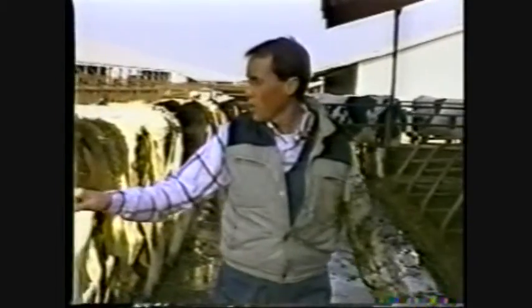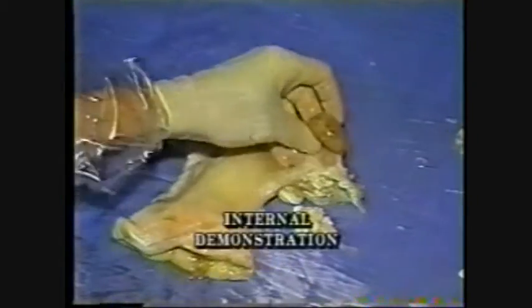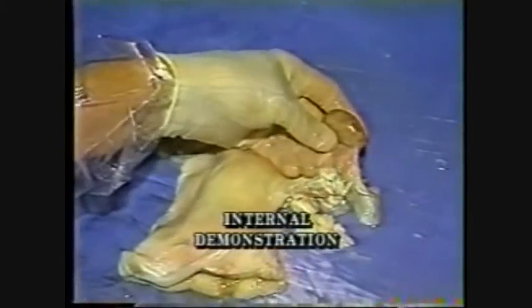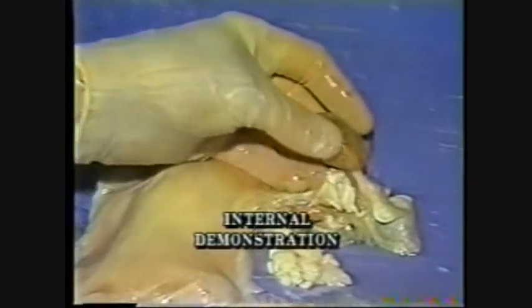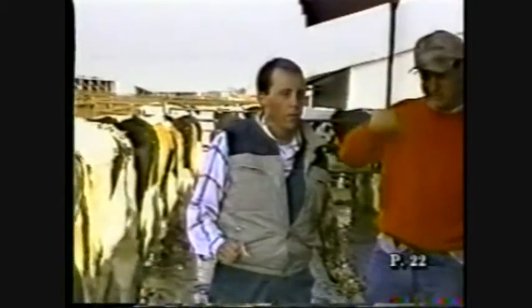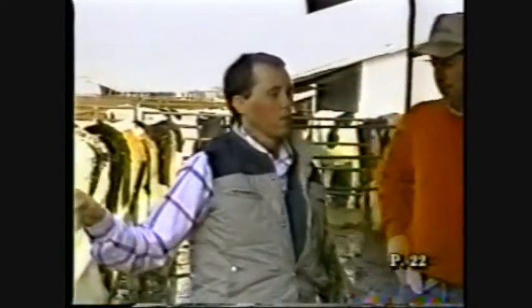Who's this next group? Guernsey no name. What did we find on her? CLR. She's all right, too. I wasn't really sure. I put R right over it with an F kind of for a follicle. She was tough for me to pick up something that would convince me. 6090, looks like. Yeah. I put CLR. 6090, CLR.